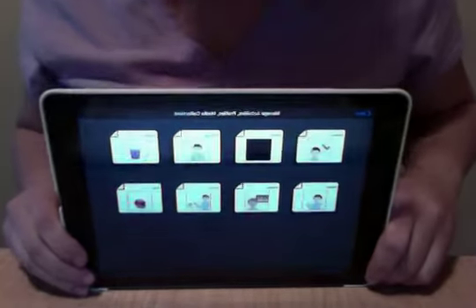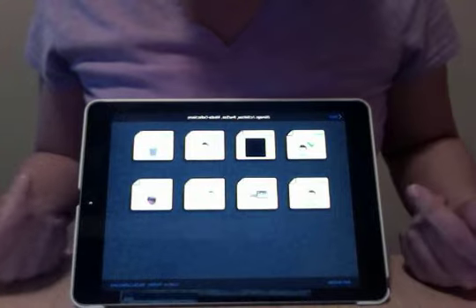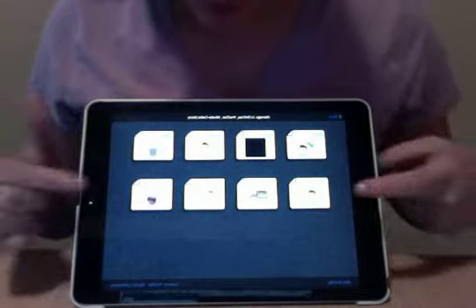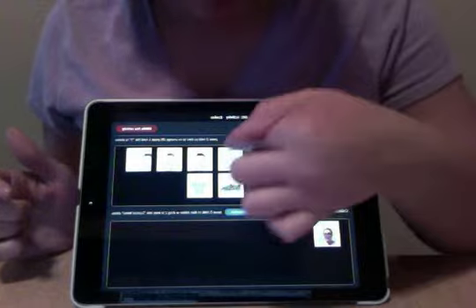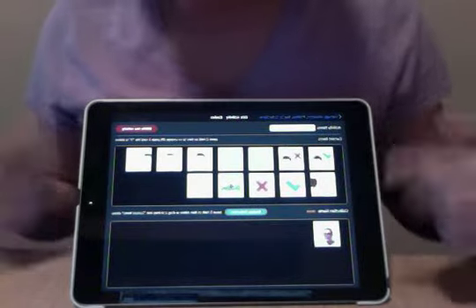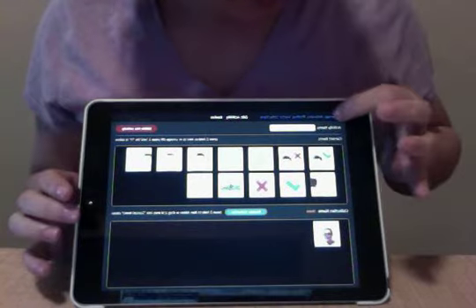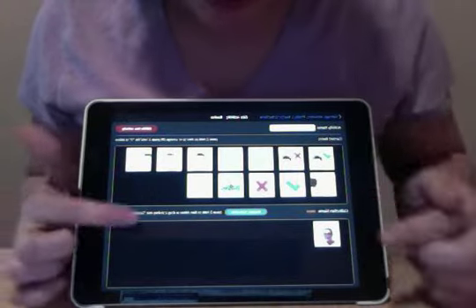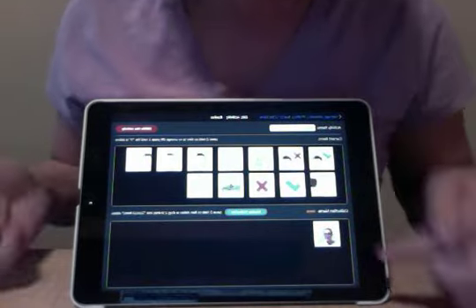Two computer screens going together is really difficult to see, but you can manage the activities, the profiles, and the media collections in the program. So it comes preloaded with some really generic stuff. Basics, which is like yes, no, many, few, goodbye, correct, wrong, shoe, t-shirt, hello. So I'll show you. And you can change the names of these. You can add them, delete them, whatever you'd like. And then you can also add your own collections. I briefly made one with literally just my picture on it, just to show you what you can do.